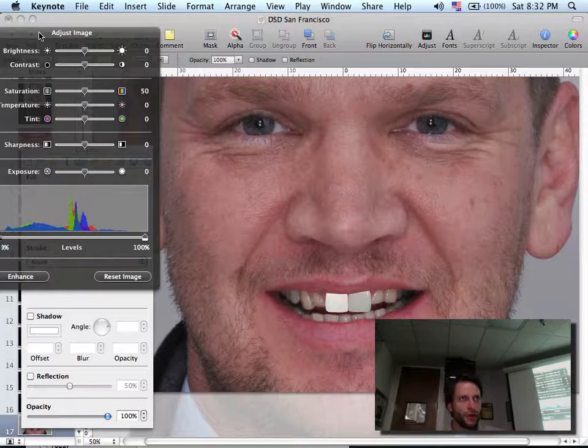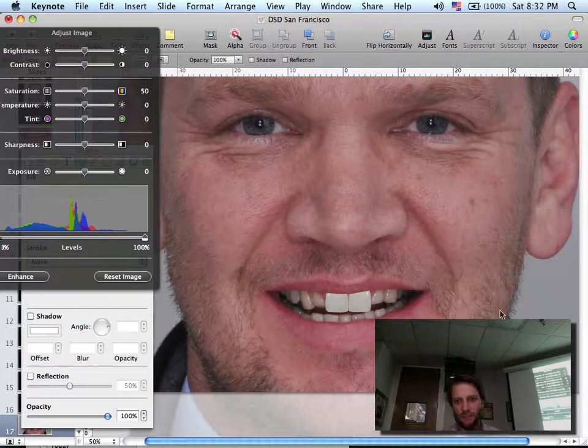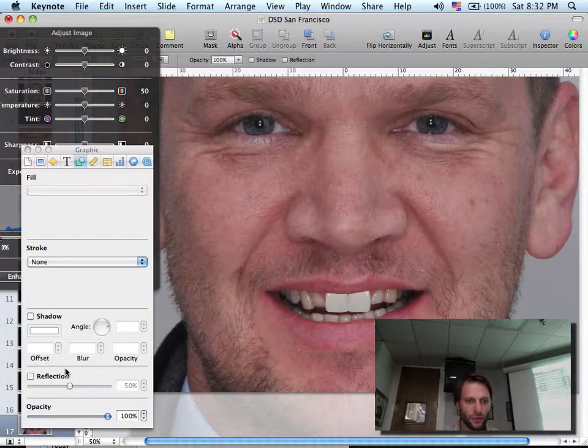That's okay, you can do that. First, it takes a lot of time and you need specific software, and it can work against you because you may not achieve that kind of result. So I prefer a simulation that gives a nice illusion, but at the same time you can see that it's fake. That can just be enough for the patient to understand what can be made and improved, but at the same time you can do it fast. So you can do this kind of simulation.